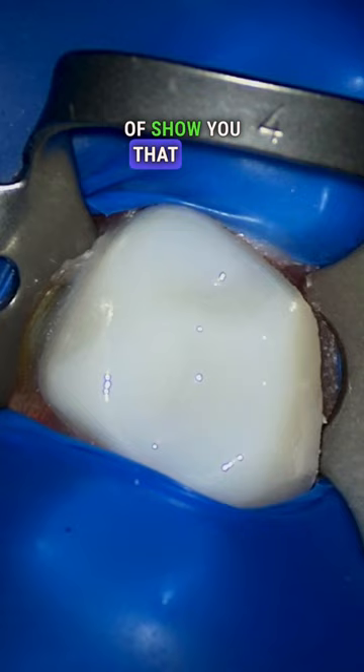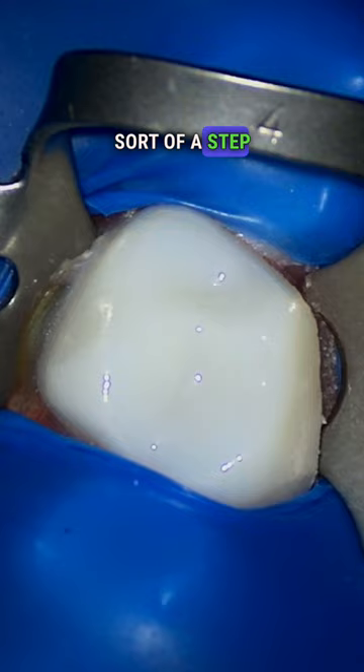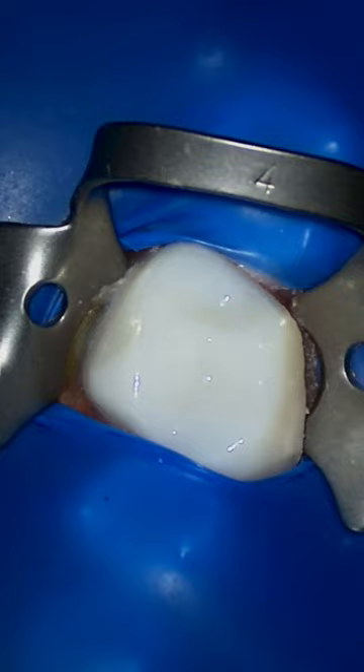Let's take a look at what can be done underneath the microscope. One of the incredible features about this particular scope is that in the past, we've had sort of a step magnification. That would mean that you would click from 4 to 6 to 8 to 10 to 16 to 24. What you'll see here is that instead, I actually have the full range available to me.